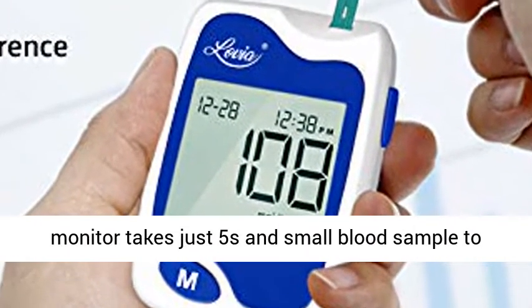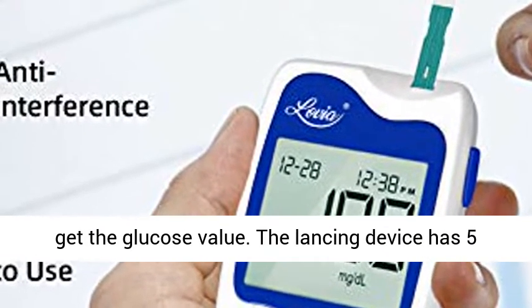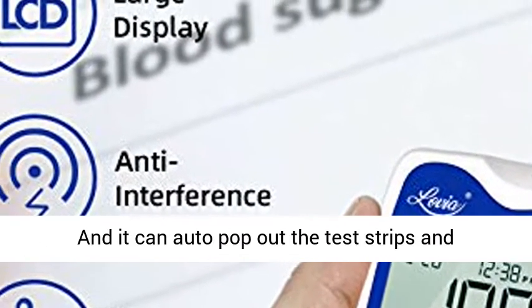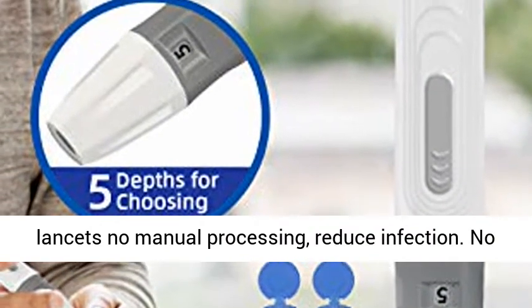Fast and pain-free: this glucose monitor takes just five seconds and a small blood sample to get the glucose value. The lancing device has five depth options to minimize wound and reduce pain. It can also auto-pop out the test strips and lancets — no manual processing.